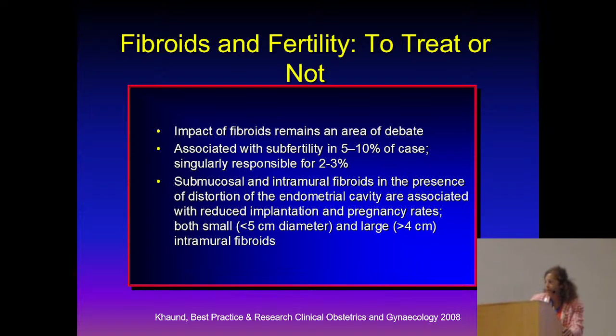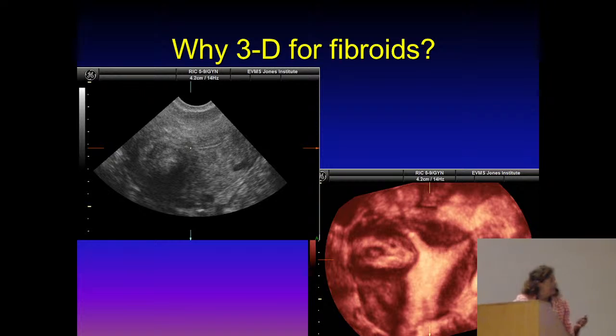We don't have to convince this group here, but 2D, you have basically this one here. I didn't try it. So you have your fibroid, and then with 3D, does it go this way or this way? The pointer, oh, there it is, second one.